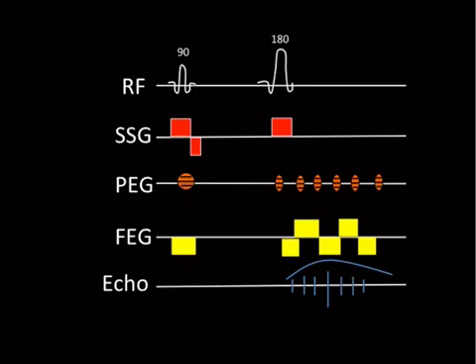They're one of the fastest acquisition methods, and you can get a lot done. One RF pulse is used to acquire data for an image, sort of like a single shot. The sequence works by turning the phase encoding and frequency encoding gradients on and off very rapidly, and because of this you get a really rapid filling of K-space.